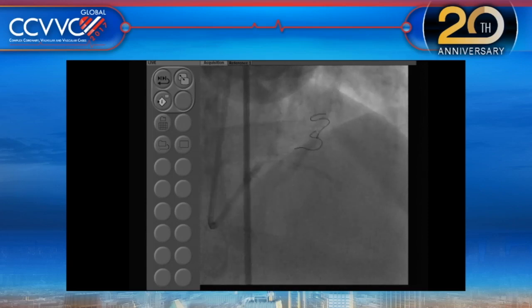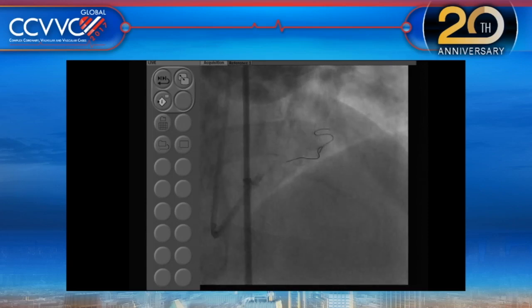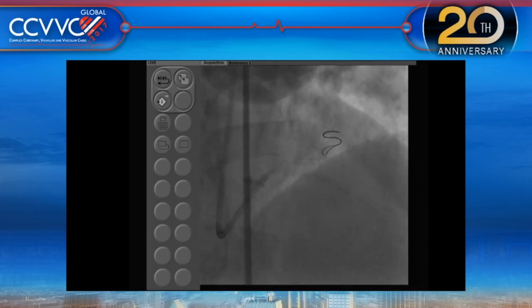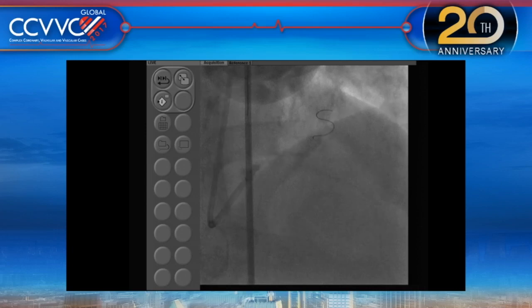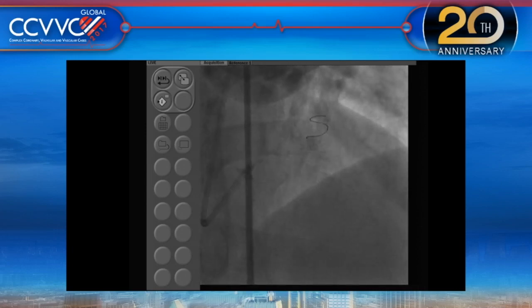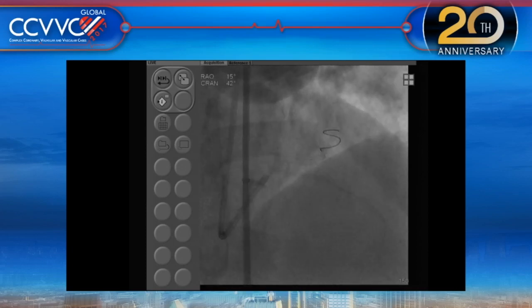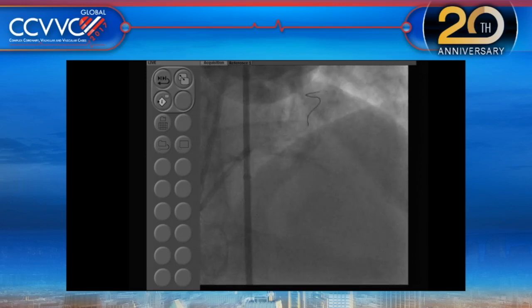No. Okay, good. But just to think of it a different way for the hybrid, sometimes you can create stenosis in the LAD. So if you come in here and just treat this as more simple circ disease, stenting from the LAD into the circ, you'll shift plaque over, and then come back and do a robotic LIMA. Can I have the fluoro, please? At this point, when you're seeing this, you probably want to proceed, but it's a very good point. Any other comments?